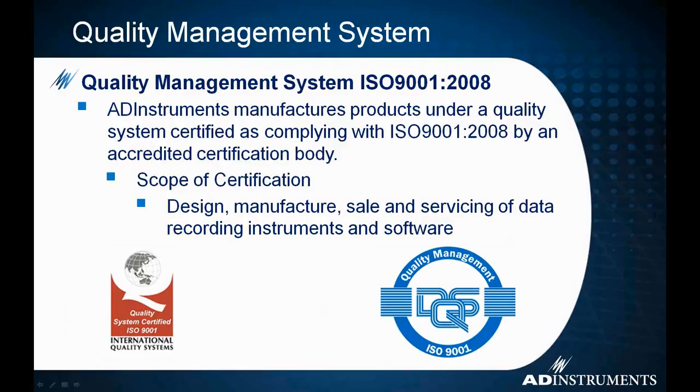So if you need this for some sort of laboratory approval, by all means we can supply this to you. There's a copy of our certification on our website. So if you can find it there, go ahead and download it and give it to whoever your review board may be. Or if you can't find it, definitely give myself or Emily a call, or your sales rep, and we'll be able to supply you with the certificate.